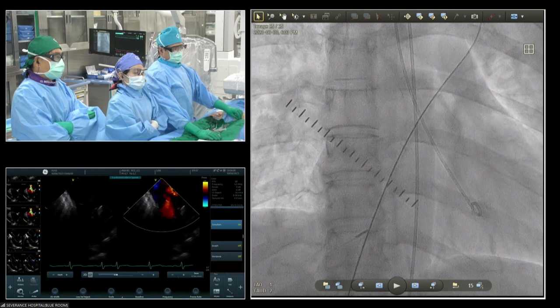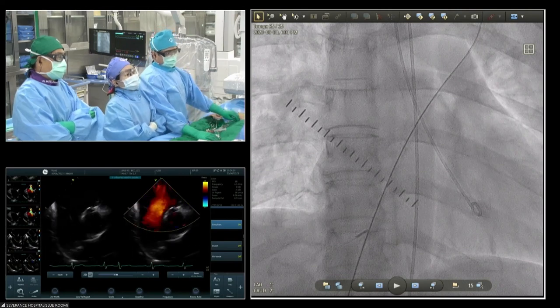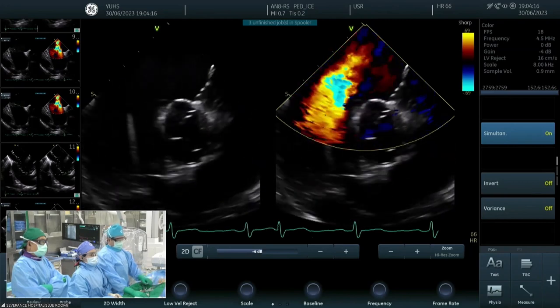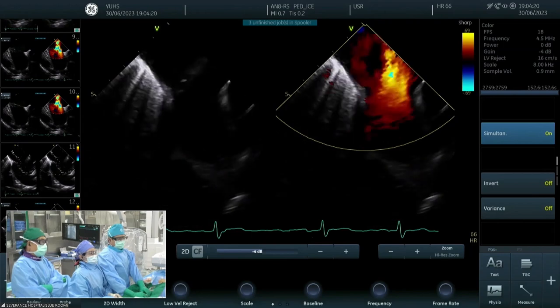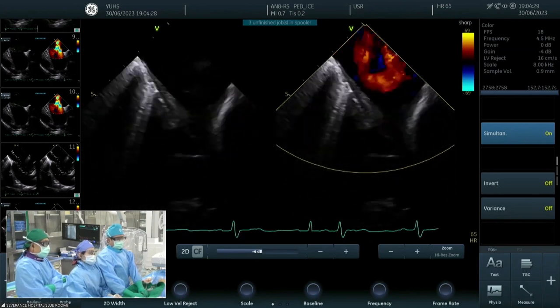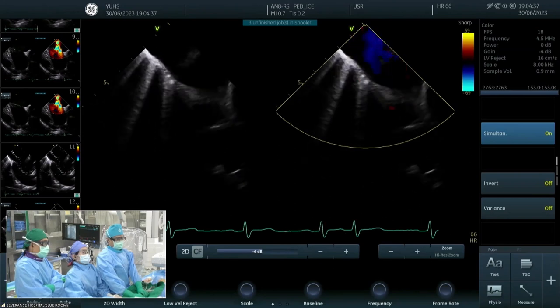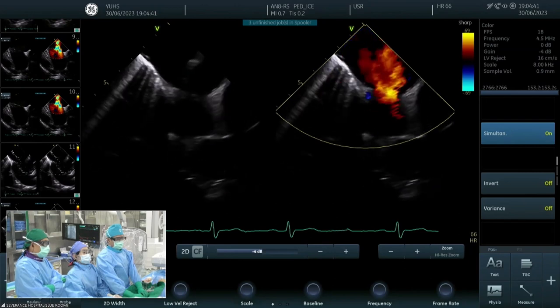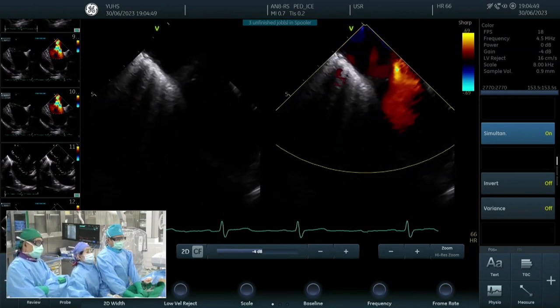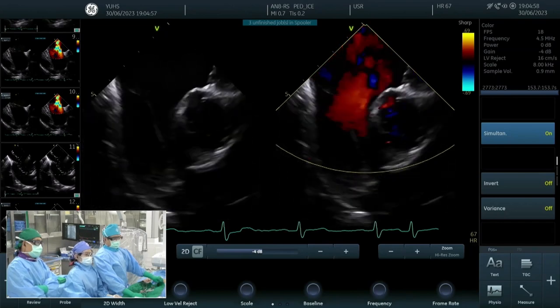So I'm going to show the intracardiac echo findings. Do you see the intracardiac echo? Yes. It is a short axis view of intracardiac echo. You can see there is a retro-aortic rim deficiency. You can see some flimsy posterior rim there. And if we tilt a little bit to the long axis view, you can see no defect as the patient is moving up a little bit. But in some views, especially near the IVC, the rim is not sufficient. But in the posterior septum, you can see some flimsy rim. So the defect size was stuck there.